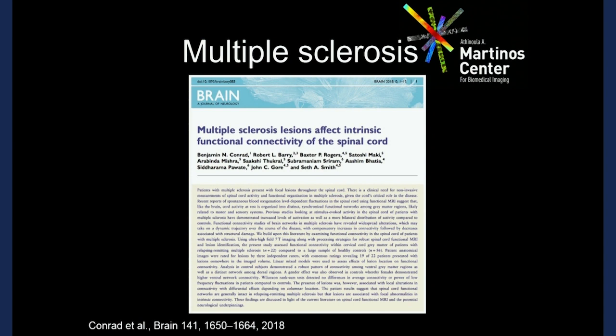So this is the first step towards looking, not only at whether the anatomy changes, but whether you can actually see, in real time, evidence of functional lesions or active lesions? And this opens up a whole new possibility of potentially studying the cord in not just MS, but in myelitis and other neurological diseases. So in summary, I'd just like you to get the understanding that the field strength matters.